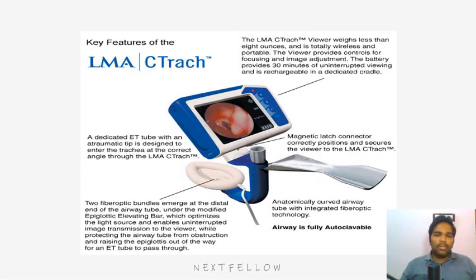Now this is called C-Trach. C-Trach is also an intubating LMA, but the only difference is we have a video camera attached to it. So that is called C-Trach. Fast track is an intubating LMA without a video. C-Trach is an intubating LMA along with a small monitor attached to the LMA itself.